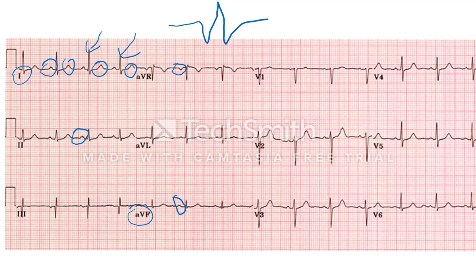So right now what I want you to know is how to evaluate for sinus rhythm, how to evaluate for narrow complex, why the ventricular myocardium would have a wide complex QRS, and always to look for T waves succeeding every QRS complex. Thank you, everyone.